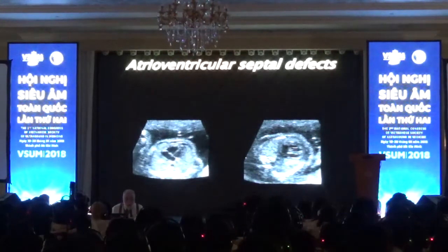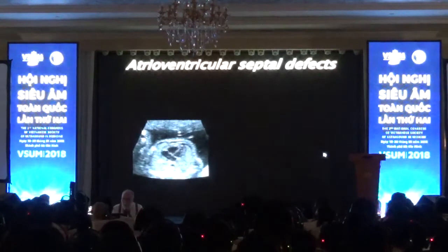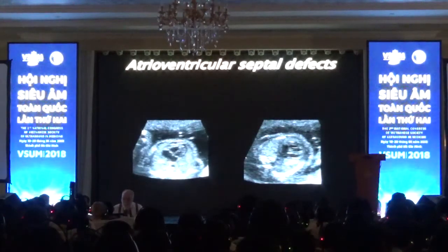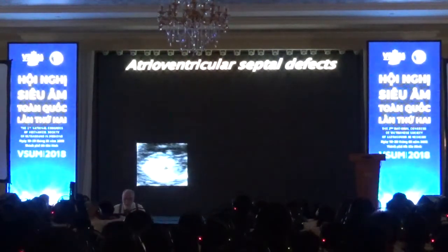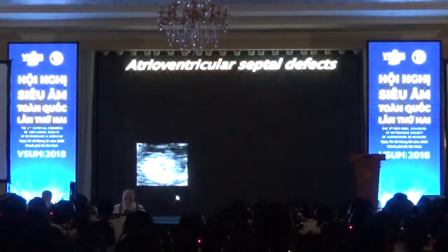This is a baby that has the incomplete form of atrioventricular septal defect. On the clip on the right side here, you can also see two AV valves at the same level. This is a much younger fetus, I think about 12 to 14 weeks, and you don't see very much in this heart, but you can see it has this irregular bradycardic rate.